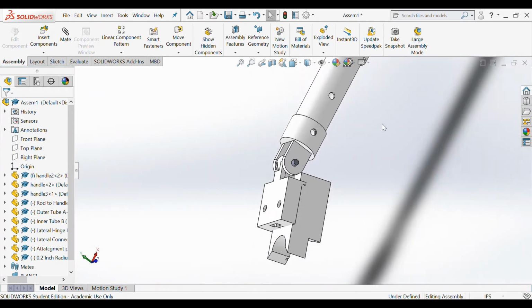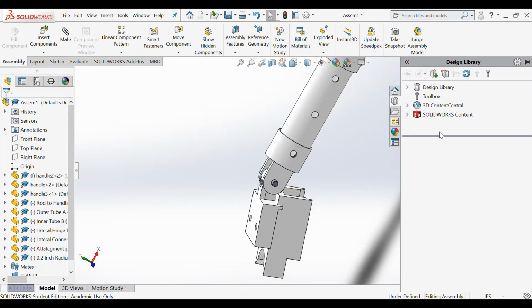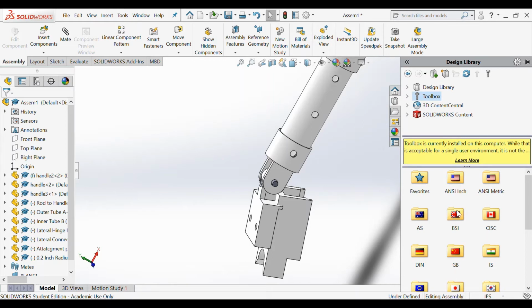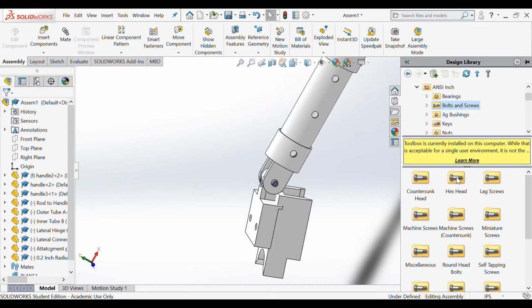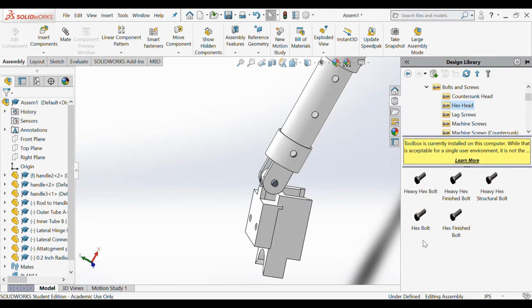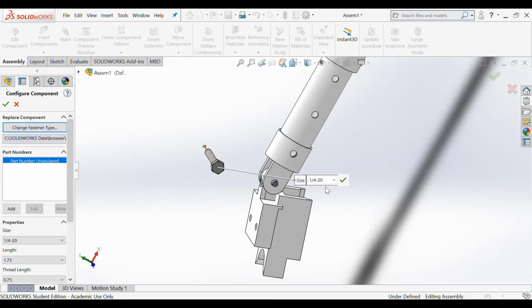So next I'm going to begin inserting our fixed pieces that will hold all of the pieces together. I'm going to go on ahead and go to Toolbox and add it in. I'm going to choose ANSI inch, and we're going to be using bolts. Next, we're going to choose hex head and just a hex bolt, and we're going to drag and drop. Now, I want my size to be 1/4-20.